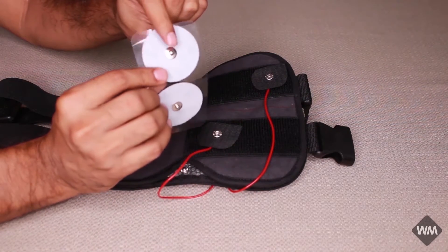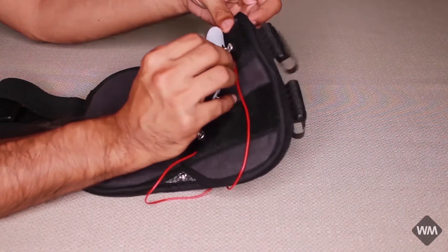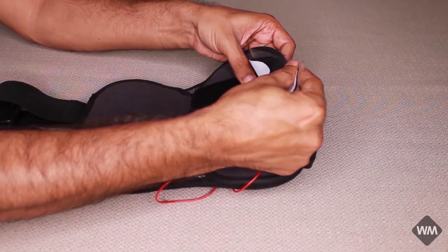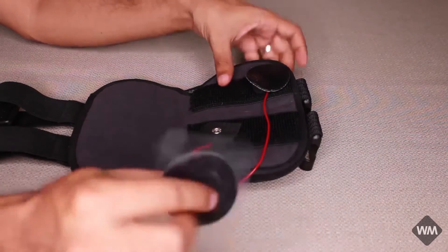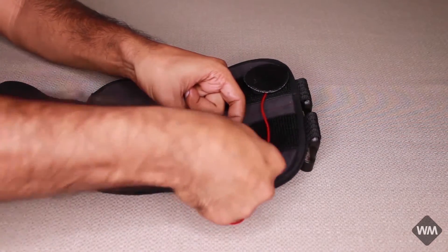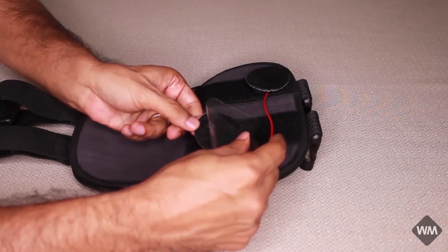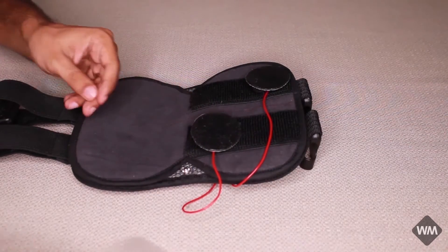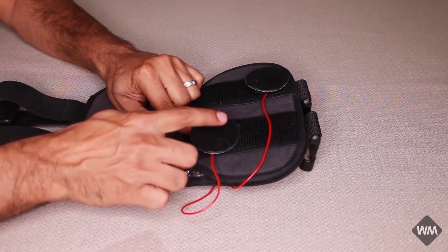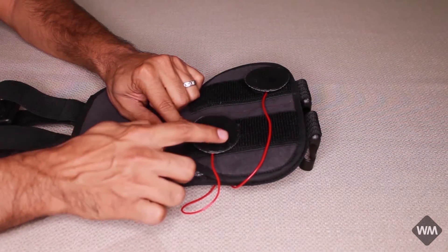This part of the electrode would go inside the button. You can remove the plastic film and this part would go into the button — you can hold it and remove it. Make sure that you do not touch the gel-filled part of the electrode.